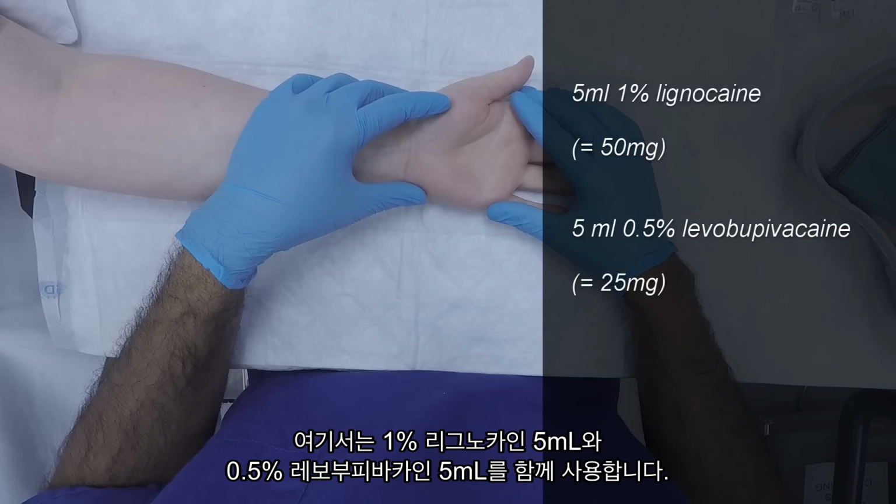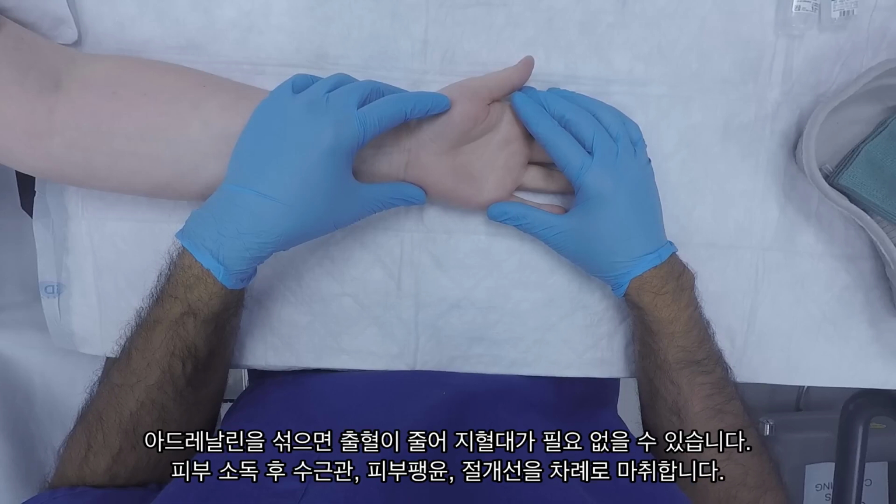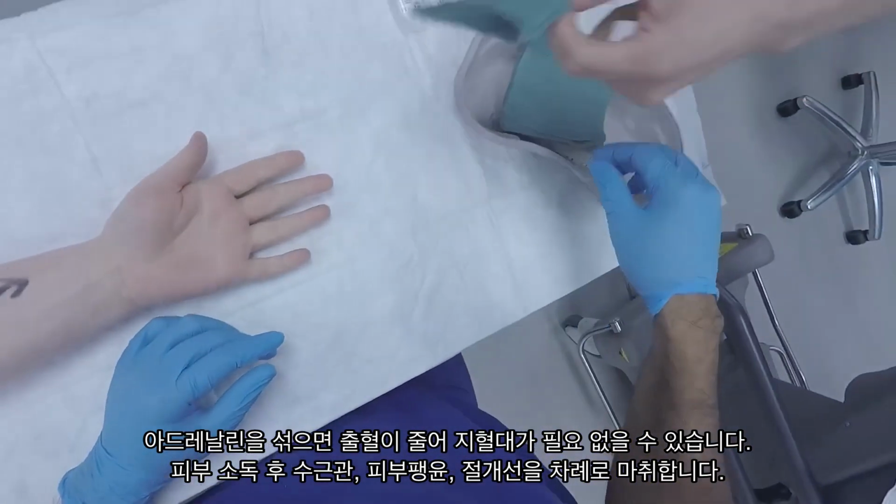If you have the time, facilities, or inclination, you can reduce the sting of the anaesthetic by warming the lignocaine to 37 degrees or by adding bicarbonate to buffer the acidity. The final option worth mentioning is the combination of a local anaesthetic such as lignocaine or xylocaine with adrenaline, where the vasoconstriction caused by the adrenaline increases the duration of the anaesthetic, but also stops any bleeding so you don't have to use a tourniquet. Prep the skin, check your local again, and then you're ready to go.